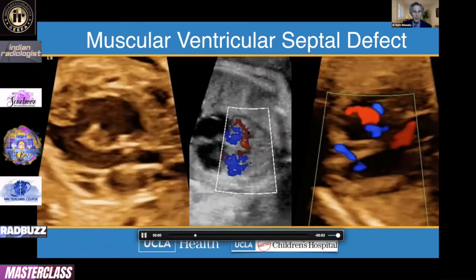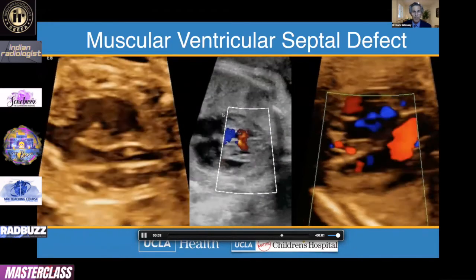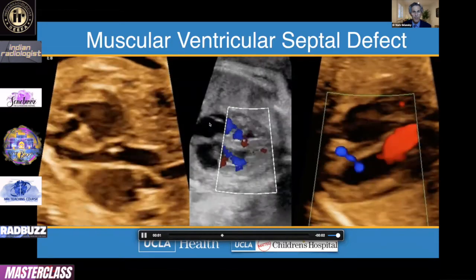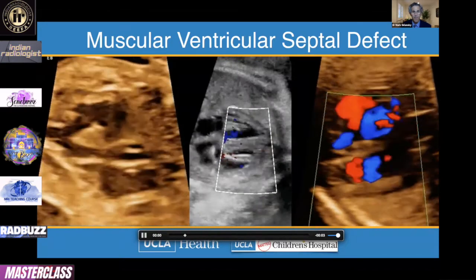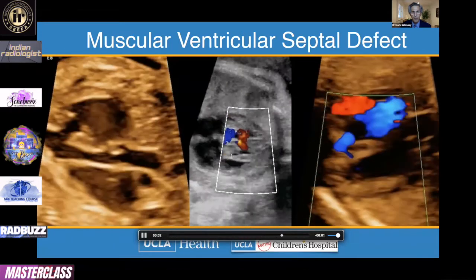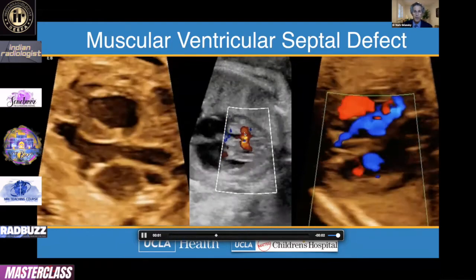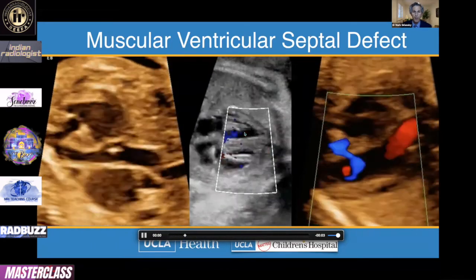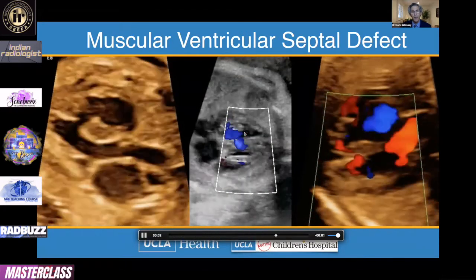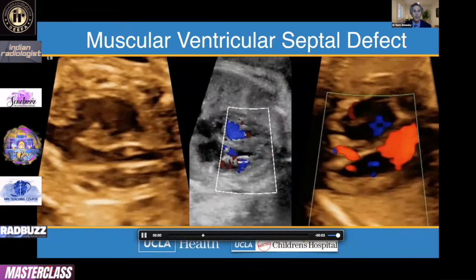Which is a little unusual. Now, if you look over here in the atrial septum, you can see the foramen ovale valve, as we talked about earlier. Here, it's very deviated, well into the left atrium, suggesting elevated pressure on this side, and in fact, the right ventricle is shunting into the left ventricle. So a little unusual. Usually the shunting pattern is left to right or bidirectional. To have strictly right to left shunting is a little unusual, although we're still sorting out why in some cases the shunting may be bidirectional, or in rare cases right to left.